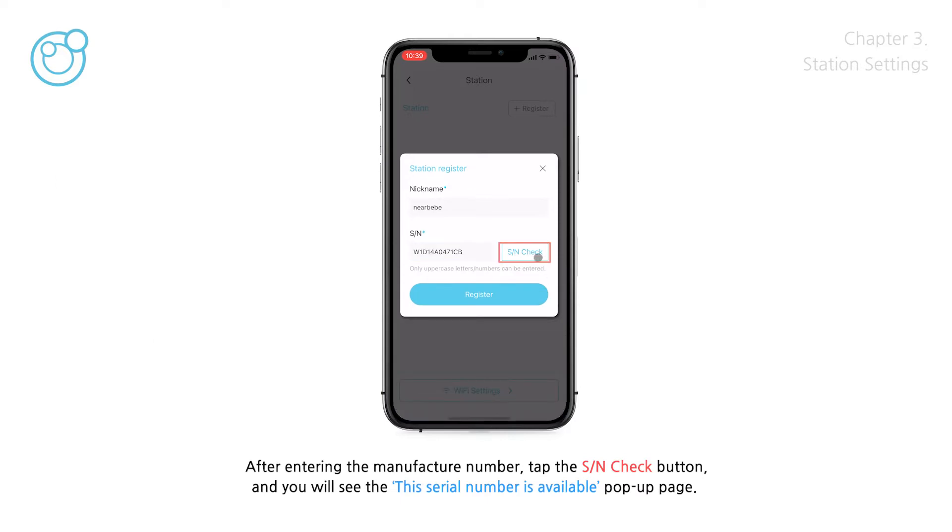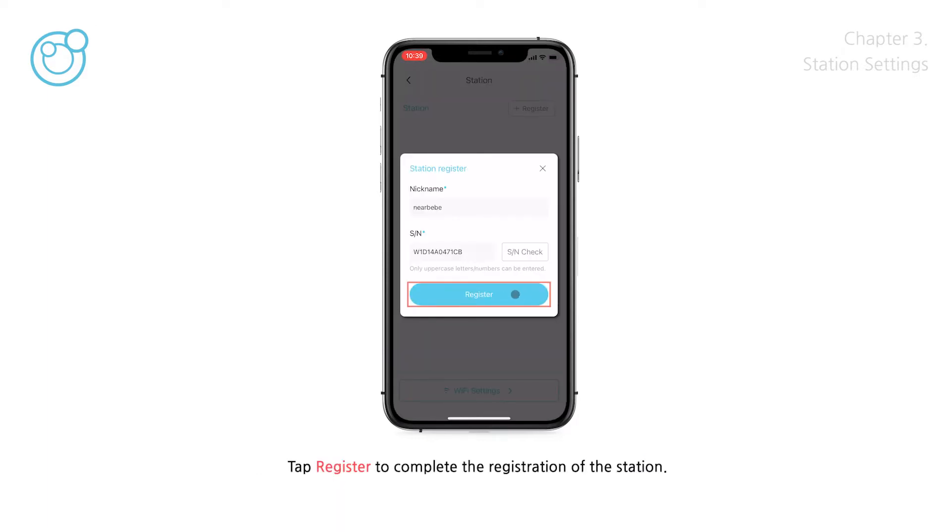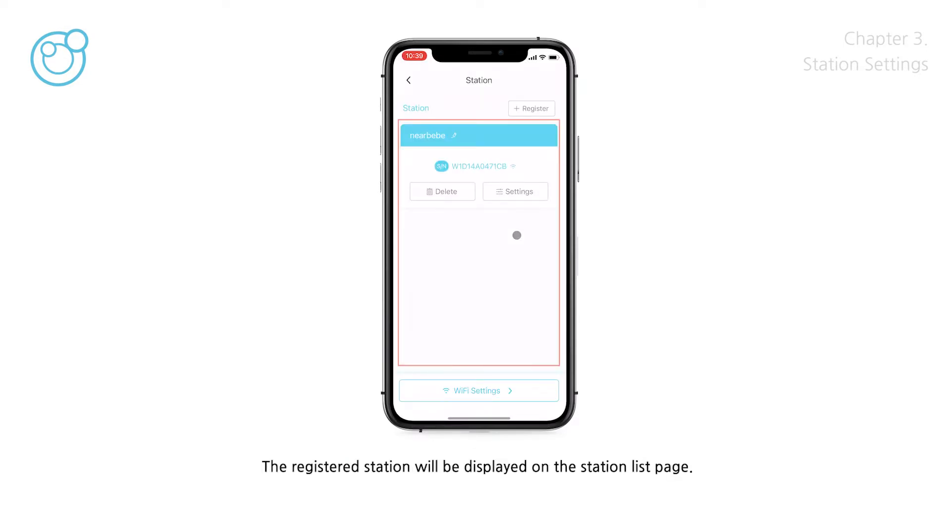After entering the Manufacture Number, tap the SN Check button, and you will see a pop-up indicating that the Serial Number is available. Tap Register to complete the registration of the station. The registered station will be displayed on the Station List page. Up to three stations can be registered.